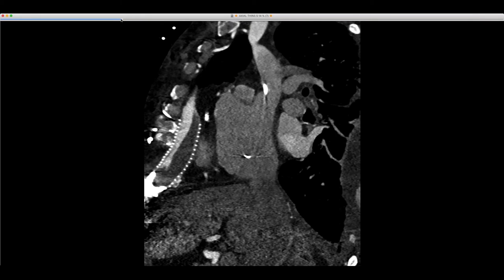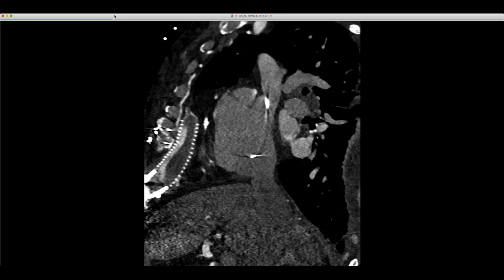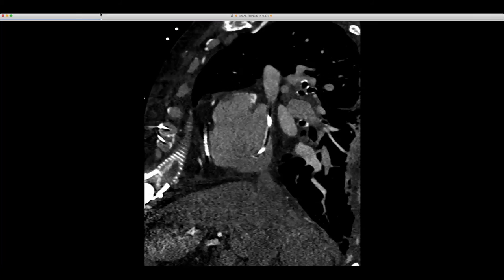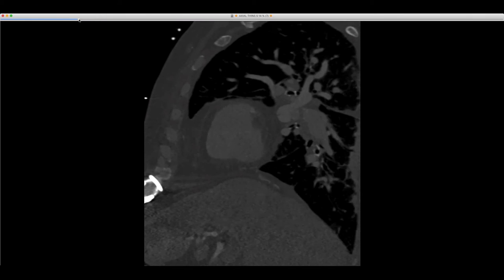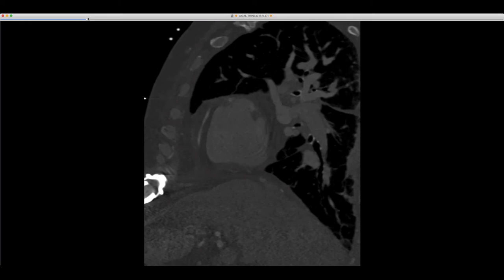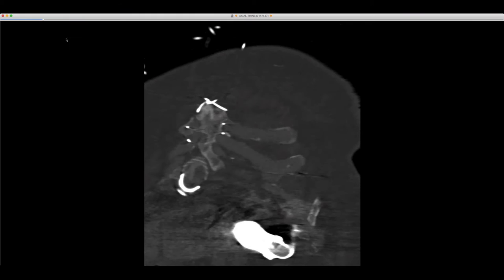It doesn't make it any less concerning because, of course, it's severely compressing the lumen of the outflow there. But you can see that the reason for this, presumably, is the dislodged bend relief down here, and it's almost better to look at it on the coronal. Presumably, these are modular, and so you can see here that this should be continuous, but this is going this way, the bend relief, and this is going that way, the modular connector.